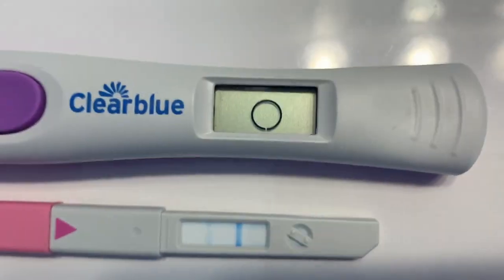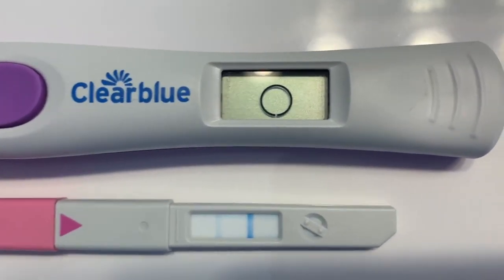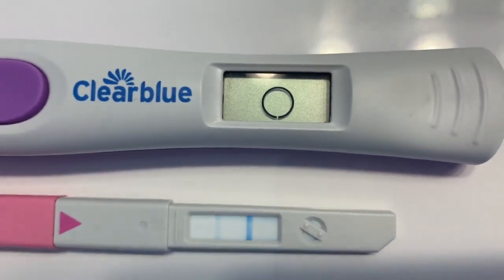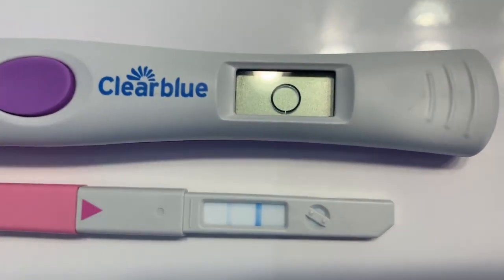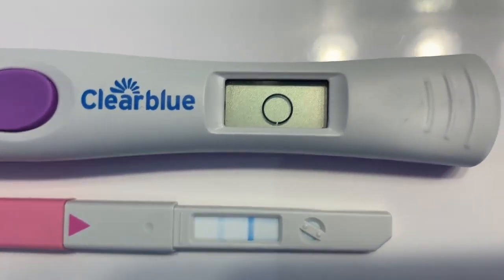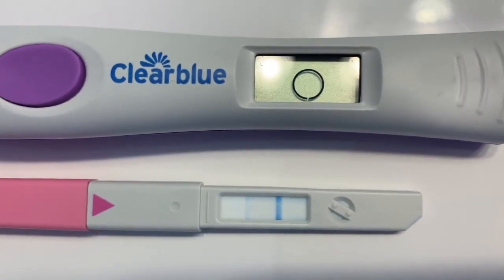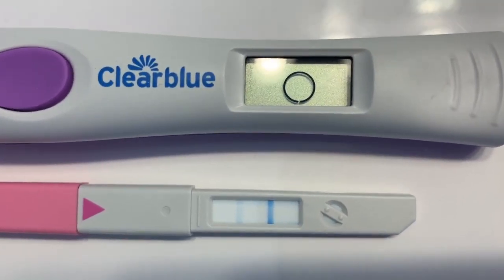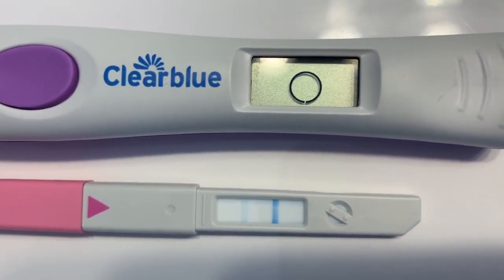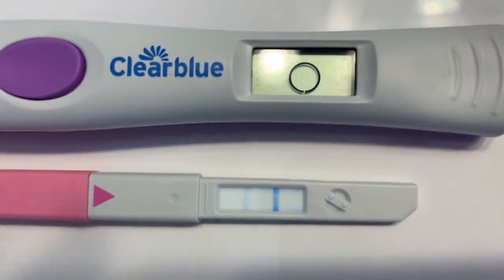I hate the TMI of it all, but the CM showed up today and it is infertile. So I wouldn't think it would be flashing right now anyway, just because of that. However, once it does turn fertile, I would hope that it would flash or just be a positive surge. I'll just see what happens tonight if I feel any pinching or poking, and I might test again tonight. But otherwise, I'm going to wait until tomorrow at 1 o'clock.